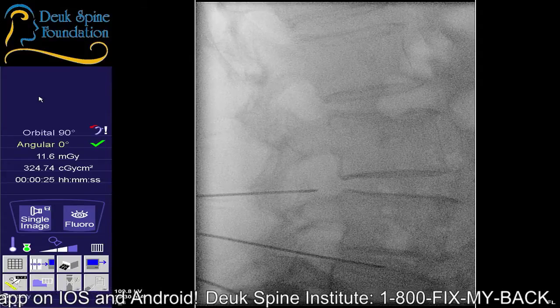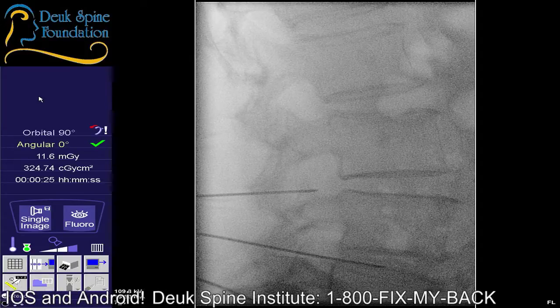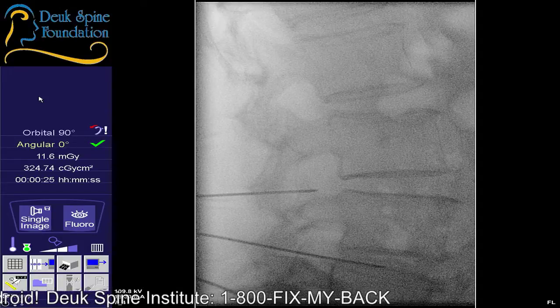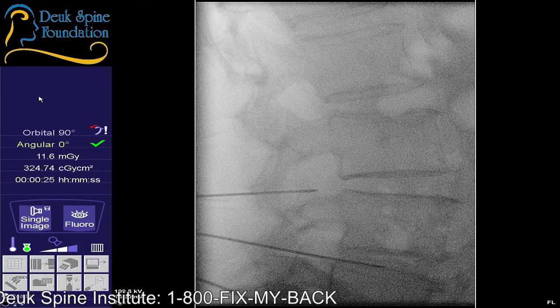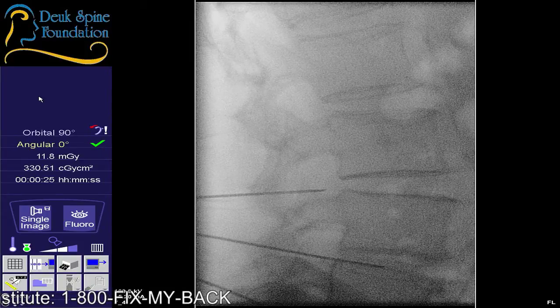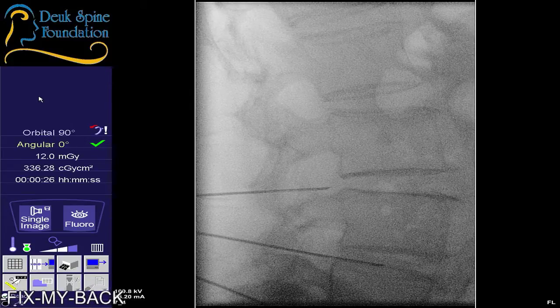And I can't believe that I'm the first person to know this. I'm sure other doctors know this. I'm sure that this knowledge is out there. It just hasn't been shared. So that's why we share it. Interesting. There may be another herniation right here.